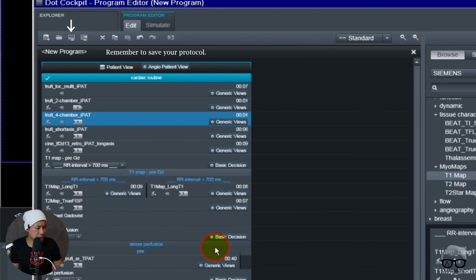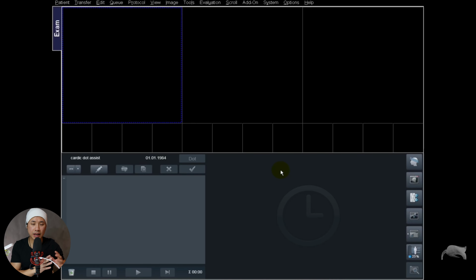So now we are more or less finished with the protocol. There's just a few more things I want to show you doing the scanning, and we're going to do some scanning as well. All right, we're going to test run the protocol. However, when I made the protocol for you guys, it took so long that I didn't have much time left to do the test runs. I had to test run another day. Whatever you see here today with the protocol might look a little bit different with Norwegian. However, it's the same setup, which I already showed you.